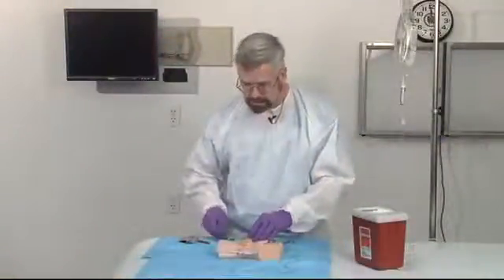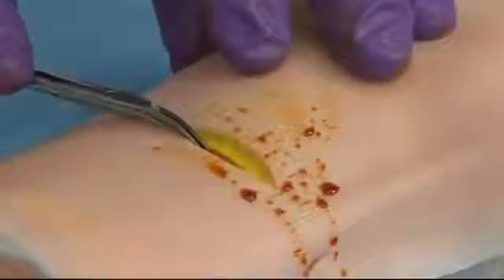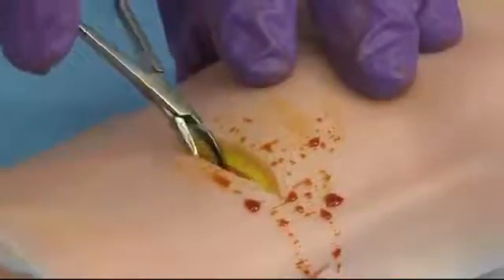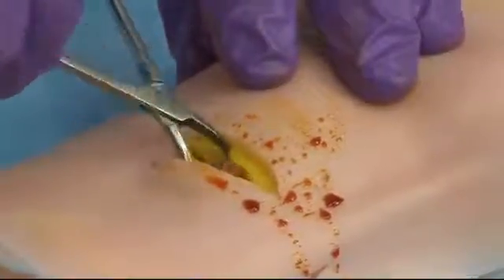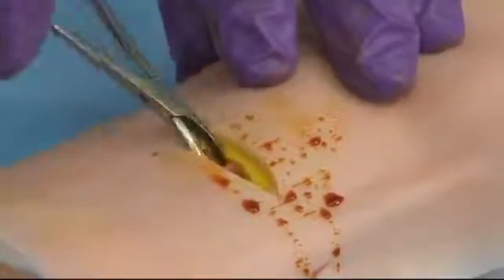Once you've made your incision through the skin and subcutaneous tissues, the key is to take your mosquito clamps, pushing down against the bone, and trying to run in line with the vessel right against the bone. What this does is actually divides that subcutaneous tissue. The goal here is you're trying to isolate the vein on either side, and I'm spreading on either side of where I think the vein is here, and I'm actually beginning to see it come into view.